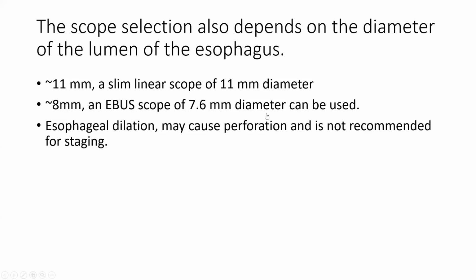Previously, there was a suggestion that you must do dilatation of the esophagus, even if it causes perforation. But today, I would say this is not recommended: to dilate and perforate and then proceed with the management. Don't dilate, don't land up in problems, because this patient is anyway going to go for chemoradiation if it is a complete stricture.